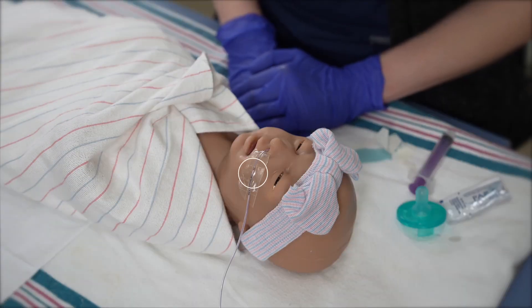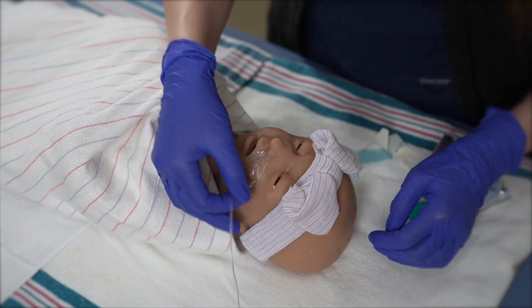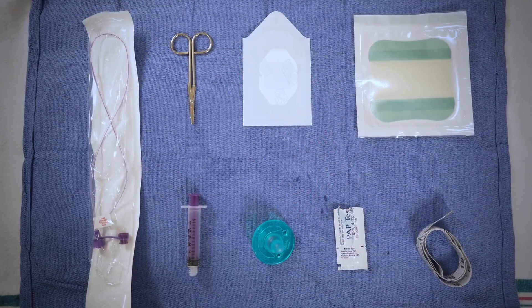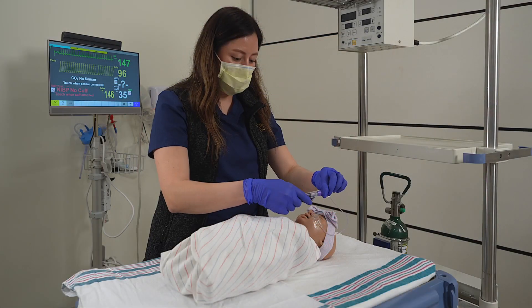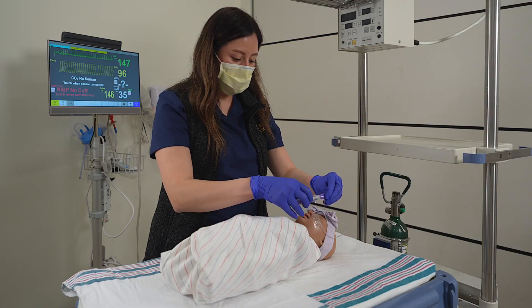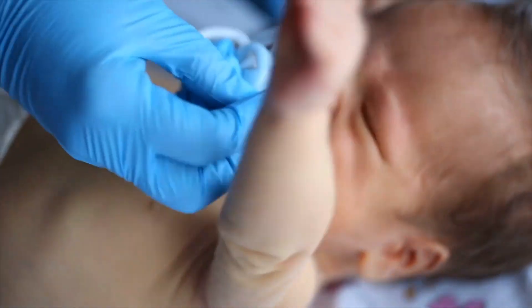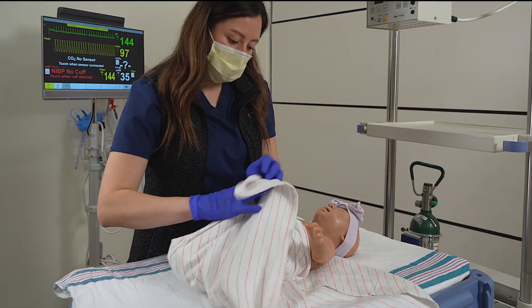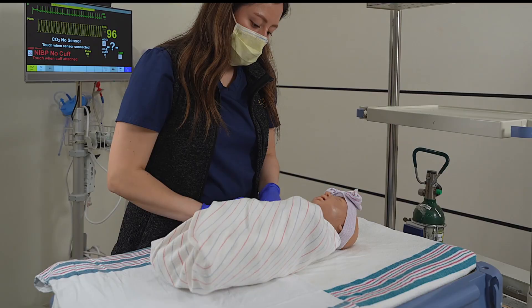An NG tube is a route of enteral feeding that is used to provide nutrition and or gastric decompression to critically ill or premature infants. Gather and prep all necessary supplies. Determine the appropriate measurement. After insertion, aspirate for stomach contents to determine appropriate placement. Provide developmentally appropriate interventions to keep the infant comfortable during insertion and once the tube has been placed to avoid accidental removal.